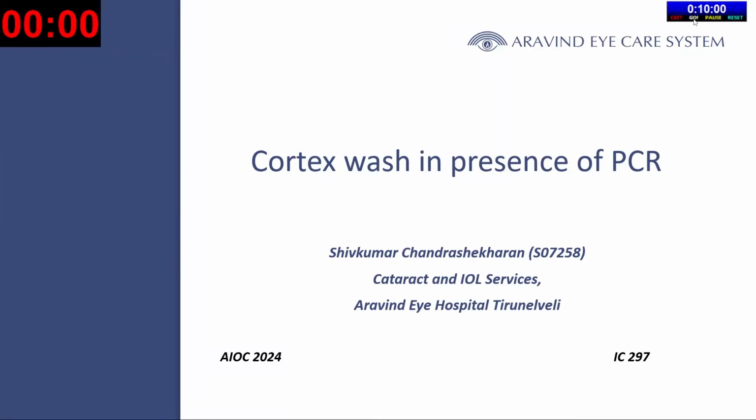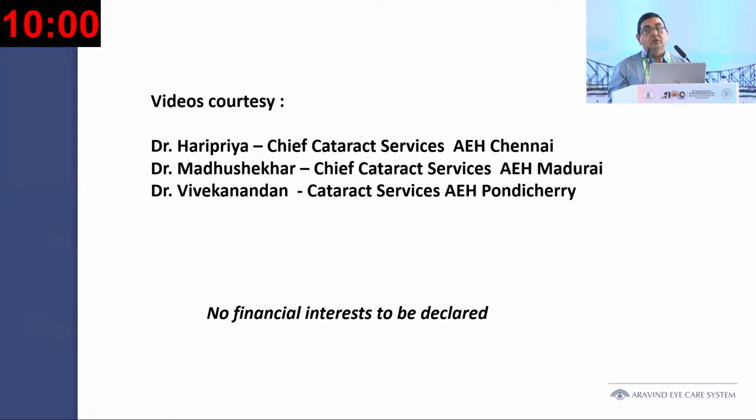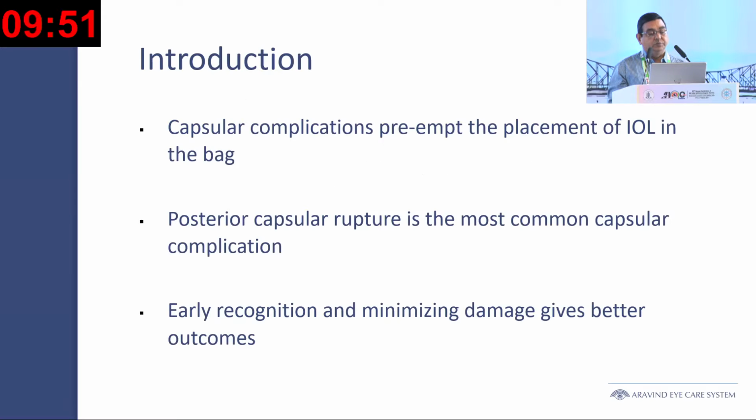So after the talks on the principles of vitrectomy and the nucleus removal, I'm very grateful to Haripriya madam for this opportunity to talk about cortex wash in the presence of PCR. I'm also grateful to Dr. Madhushekar and Dr. Vivekanandan for sharing their videos.